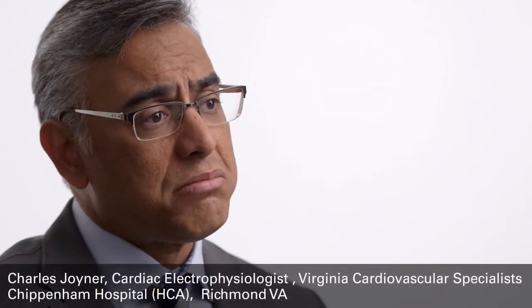We still do about 75%, 80% with moderate sedation. And just maybe here and there, someone under general anesthesia. I don't think general anesthesia is a necessity. I think it's a luxury that I have and I like to utilize, and I happen to have a very good anesthesia team. So I think, in that circumstance, it's reasonable to use it.